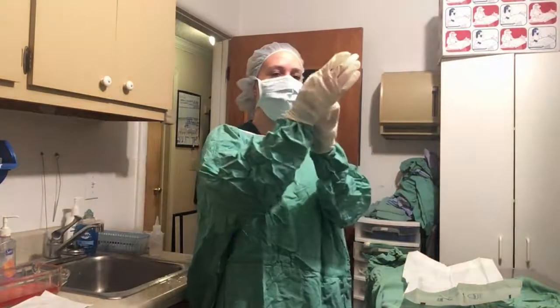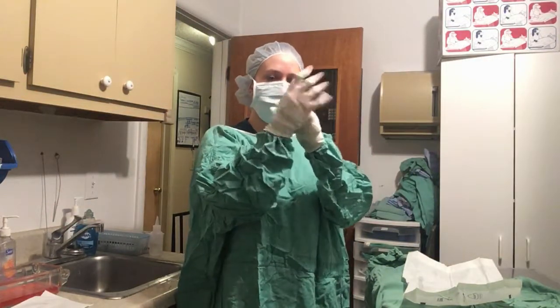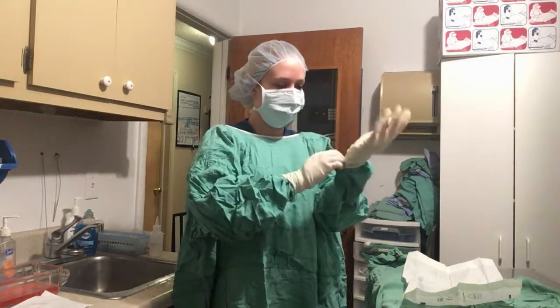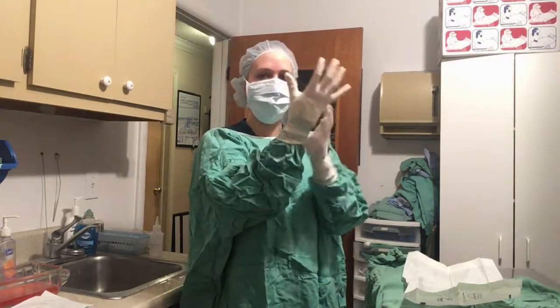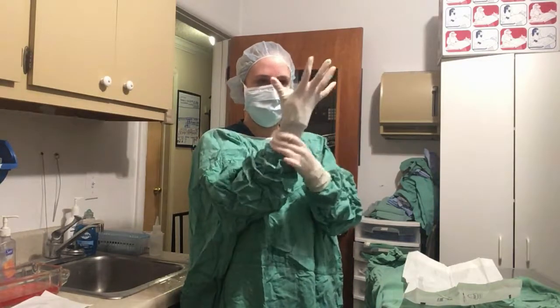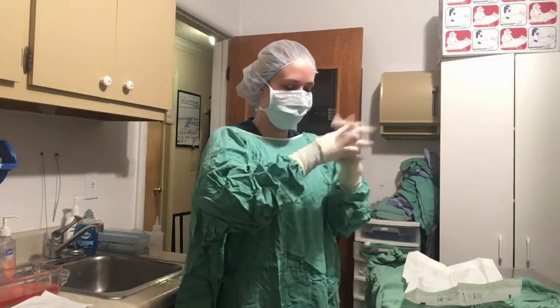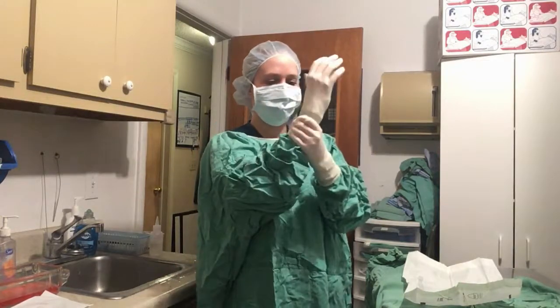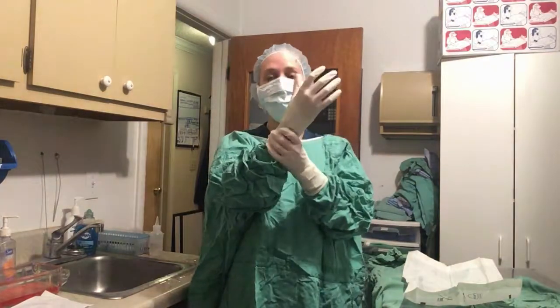Now that I have these on, I'm completely sterile. So now I can go ahead and pull down my gloves to where they are comfortable, with the ends of my gown still inside the cuff of the glove.